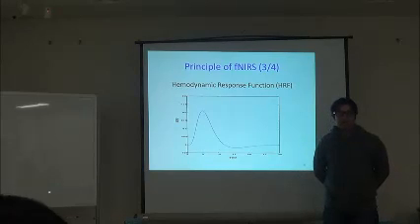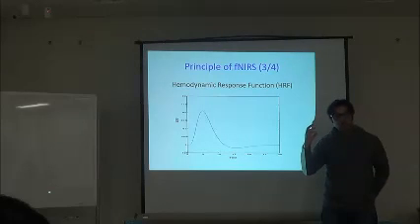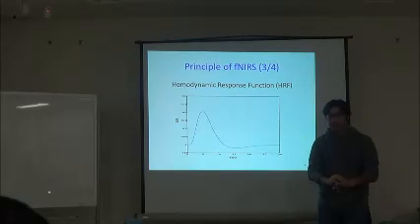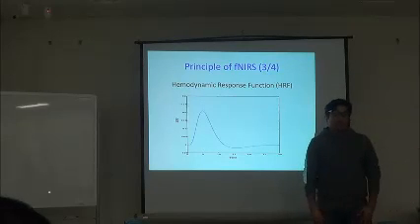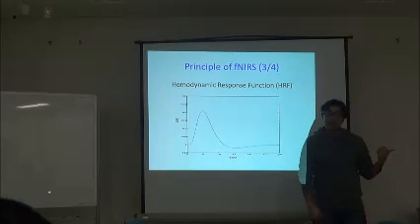But the answer is that the fast response happens because of the neuronal membranes after they fire. If we want to use fNIRS to detect just the hemoglobin levels in some other tissues, there is no neuronal firing there. In case we use the frequency domain NIRS machine, we can find the absolute values of the hemoglobins, the oxygenated and deoxygenated.